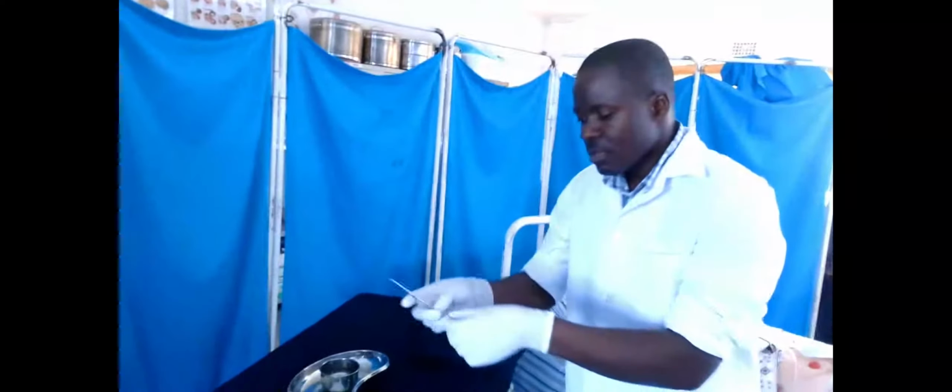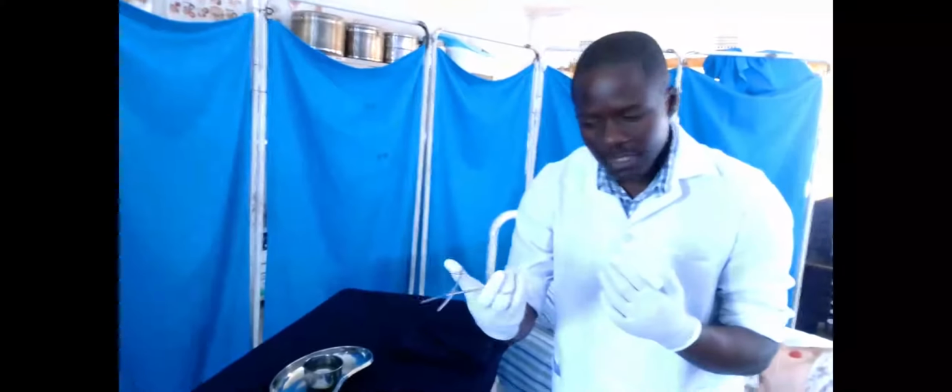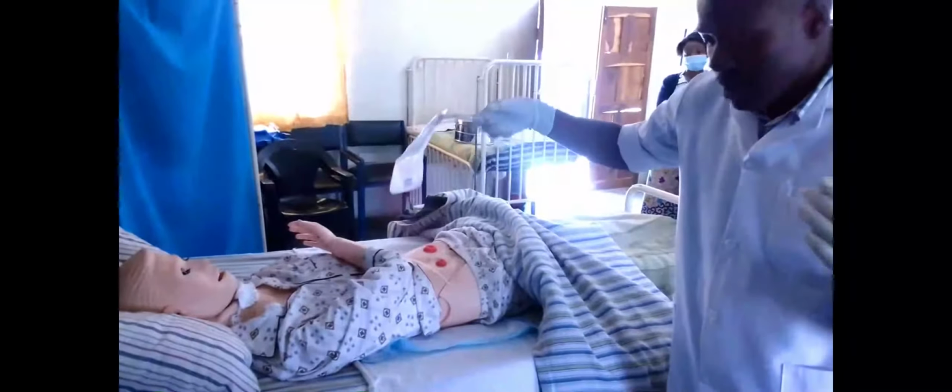So this forceps will be used in this manner. So this is how you go. You get it like that. Since you loosen it up, then you drop it there.